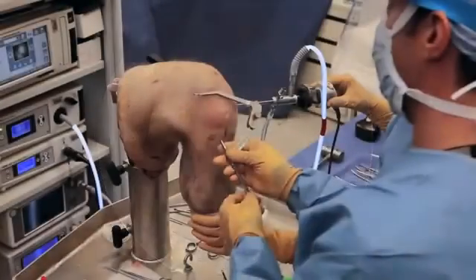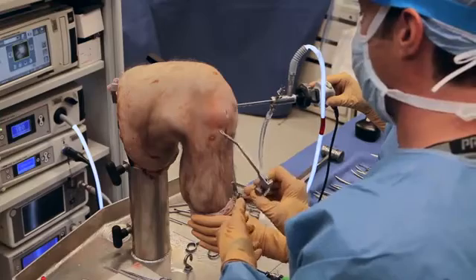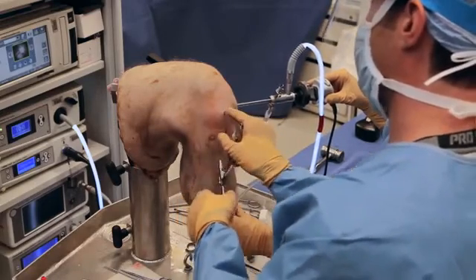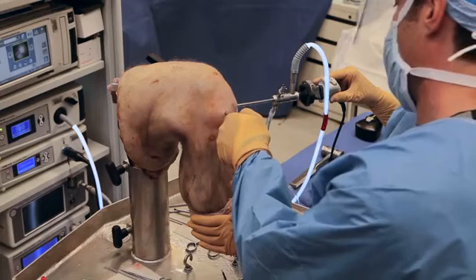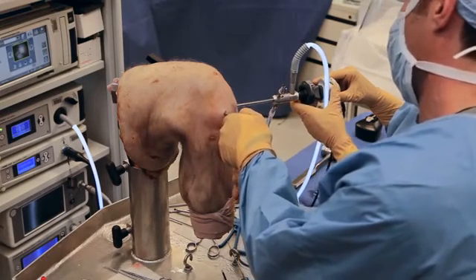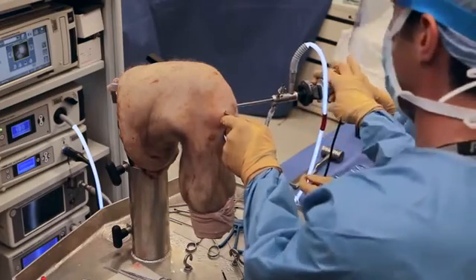So we're going to use the Biomet tibial open guide. The guide pin will go through the center of this oval portion of the guide. And I've got it set for 55. And I'm going to try and put it right in that mark that I made with my electric cautery. Let's see where I am.